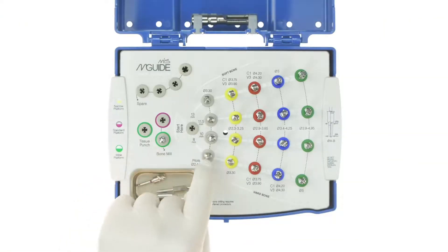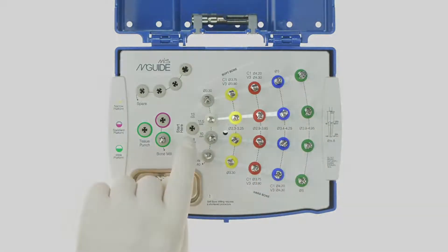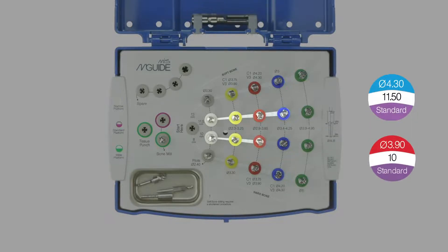Now it is time to choose your path. The kit comes equipped with a series of drills for each length of implant. For example, we will choose the 11.5 mm since it matches the implant from our surgical plan. The best part about the M-Guide set is that you have the freedom to change the implant size at the time of surgery.